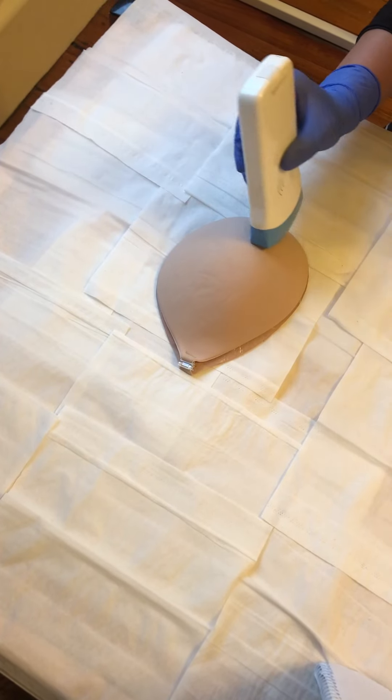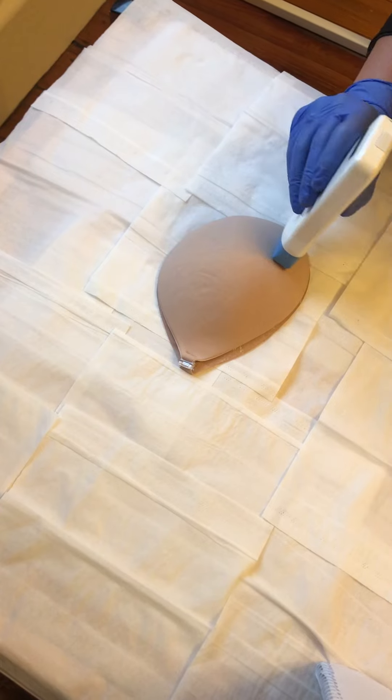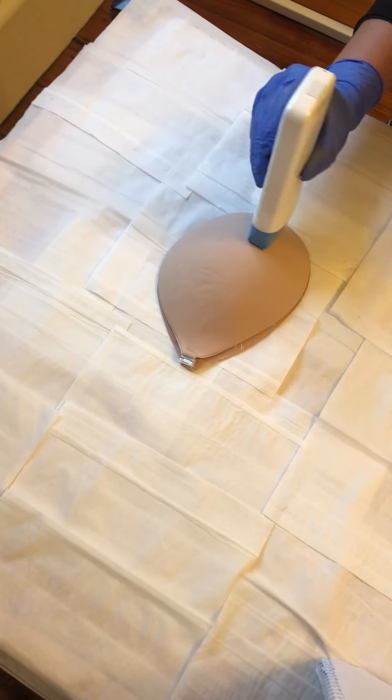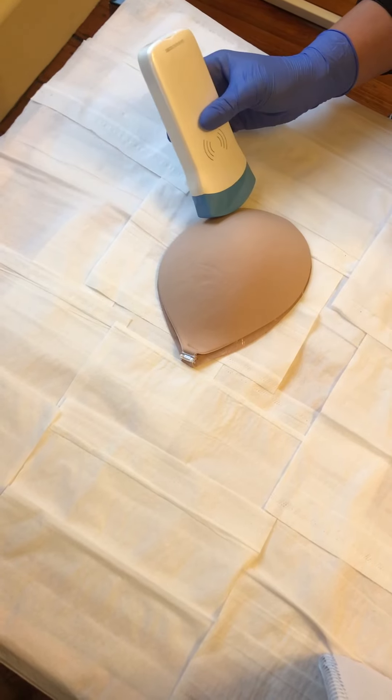Until we get to the most inferior portion and as you can see again we're slightly out of the breast here so that we're making sure that we cover the whole breast slightly out and of course the nipple as well.